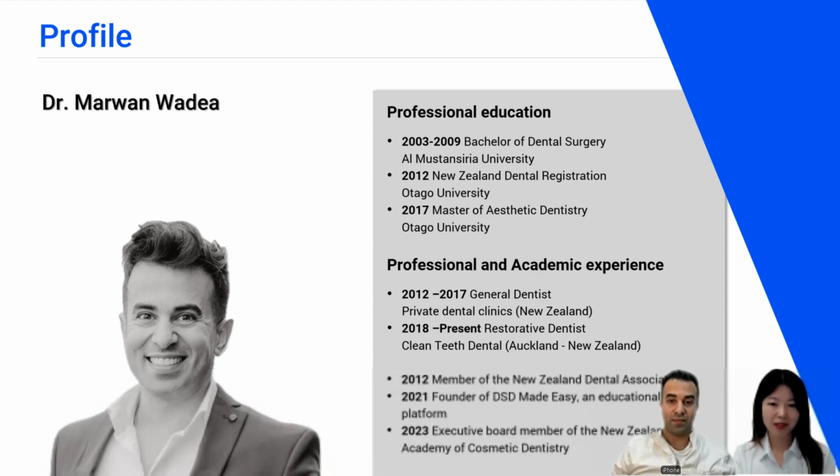So when did you start digital dentistry? I started digital dentistry 4 years ago, around COVID time, where I had the opportunity to move from analog and explore digital dentistry. I always was an analog believer. However, digital dentistry started to get popular, and I knew that there is something I'm missing out. So I jumped on board, and it was a learning curve.